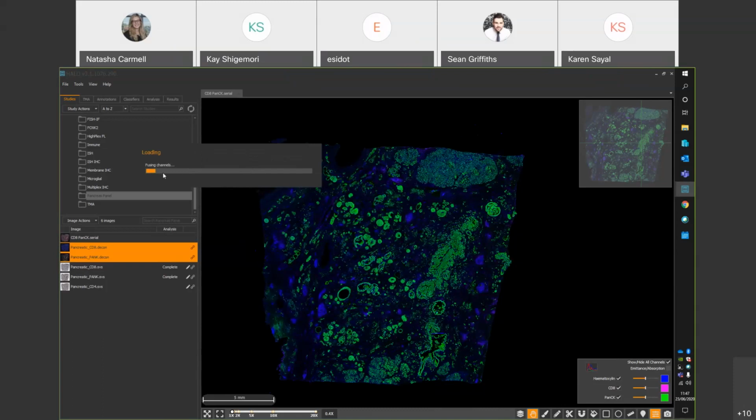So you can see it probably only takes maybe 2 minutes or so. But then once that is generated, you can use it as you would a normal image with any fluorescent module and just be analysed as normal.